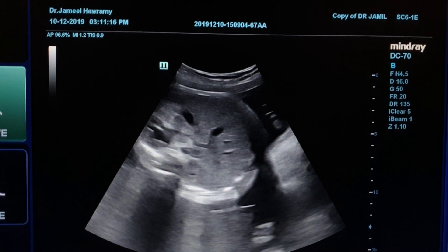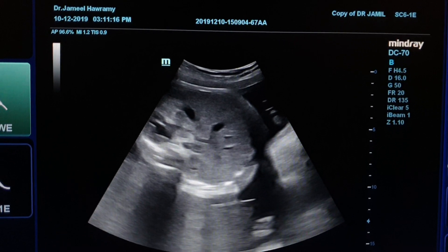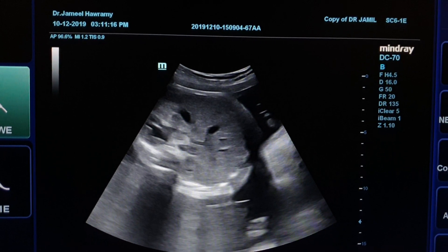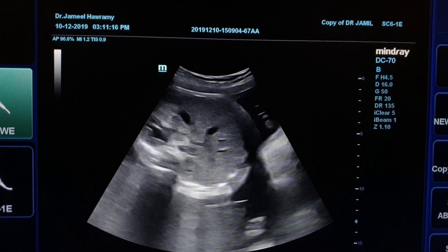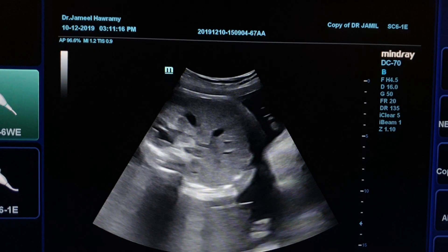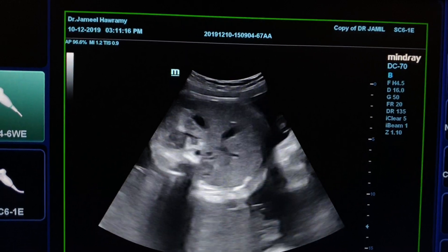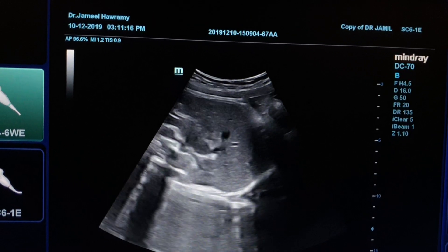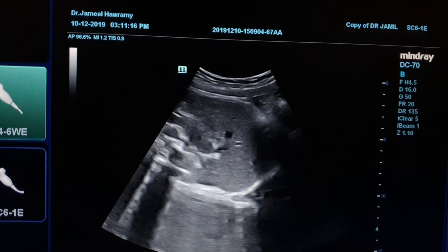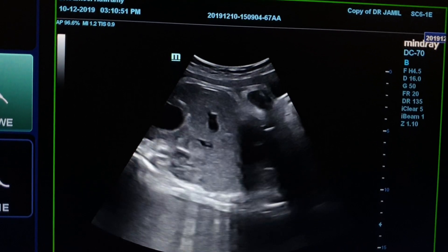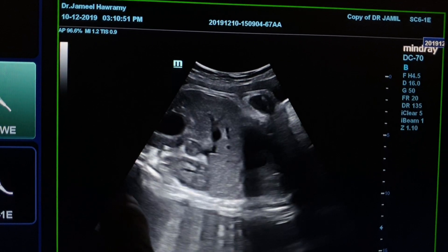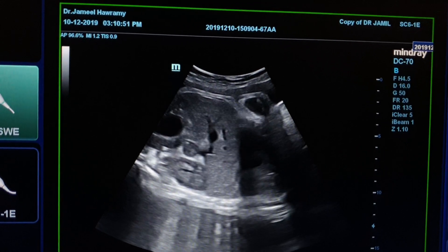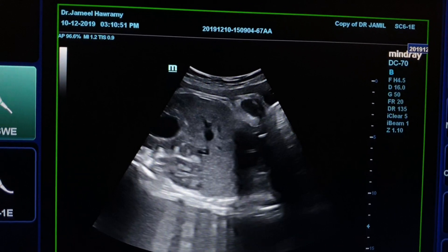Abdominal circumference, fetal stomach in the left side, left kidney showing hydronephrosis, normal right kidney. In this short clip, we see the hydronephrotic kidney and the normal right kidney in transverse section.